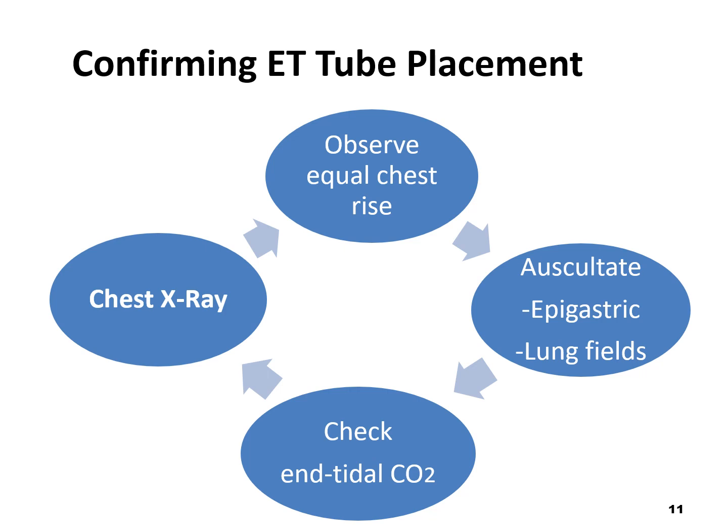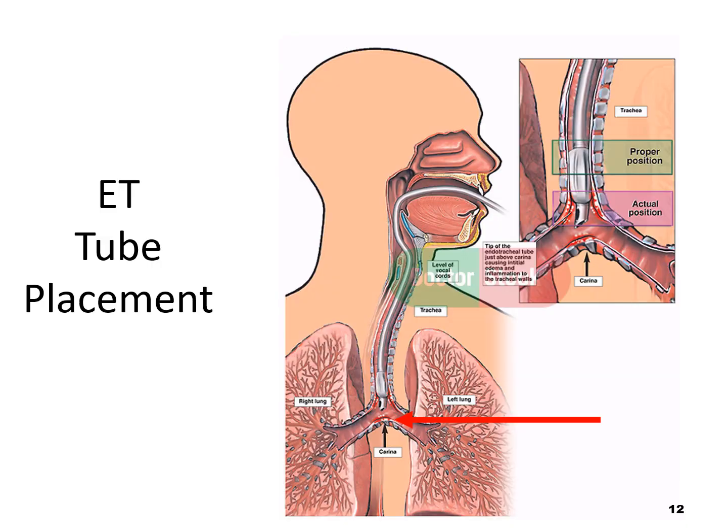A chest x-ray, definitely need a stat portable with a reading. So the goal is for the endotracheal tube to be about 2 to 4 centimeters above the carina in adults. Some textbooks state that the ET tube should be 3 to 4 above the carina. Looking at this picture, it's actually an improper tube position with a recommendation for correct placement.